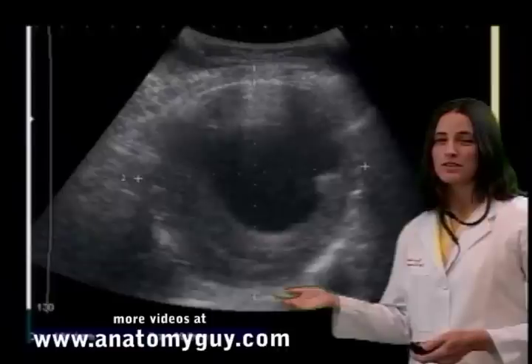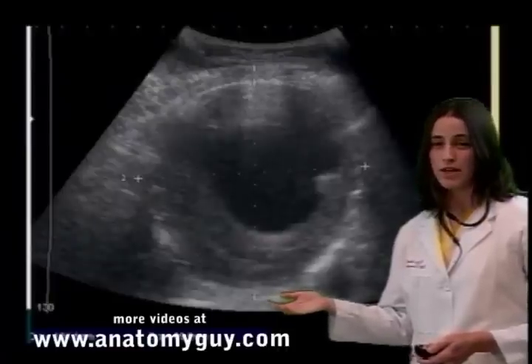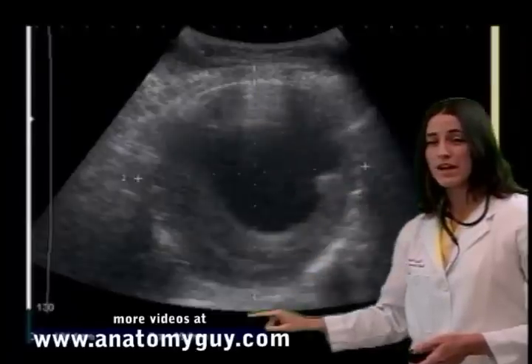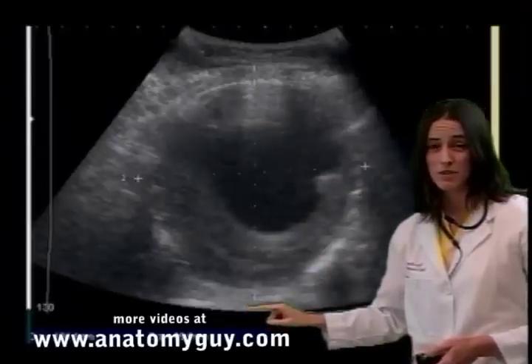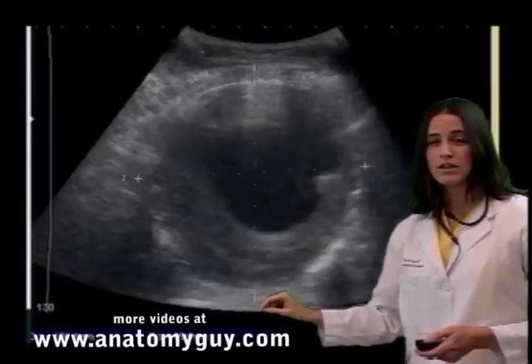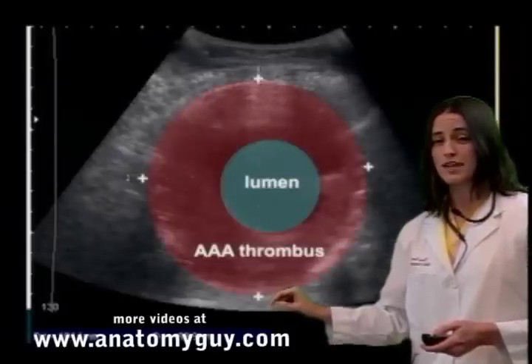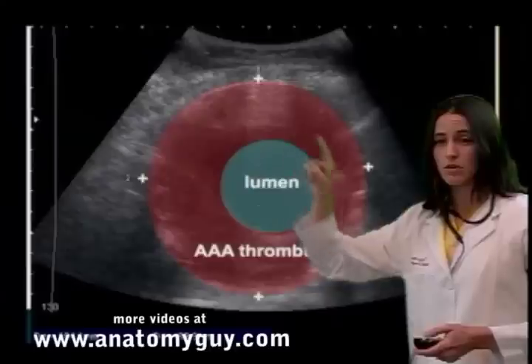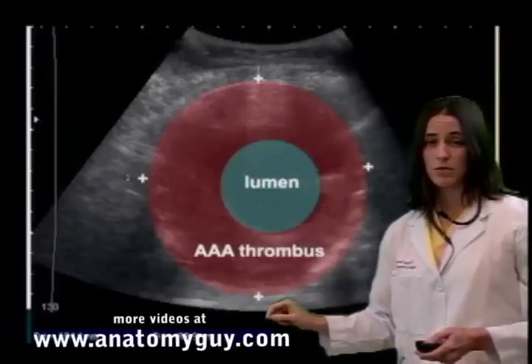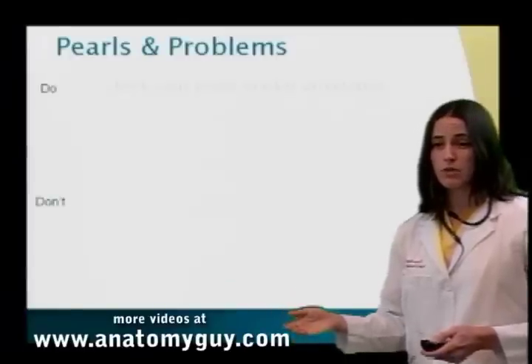Our 65-year-old gentleman: this is his transverse view of his abdominal aorta. You can see when measuring from the outer wall to the outer wall that it's measuring 10 centimeters — more than our three centimeter cutoff. Looking at the aorta filled in, you can see a very small portion of that is actually lumen; the rest of this aorta is all covered by thrombus. So our gentleman does have an abdominal aortic aneurysm.